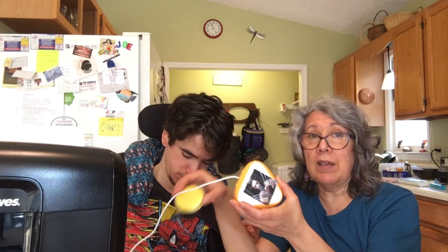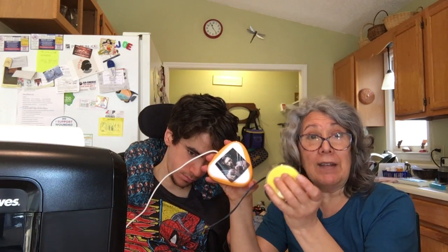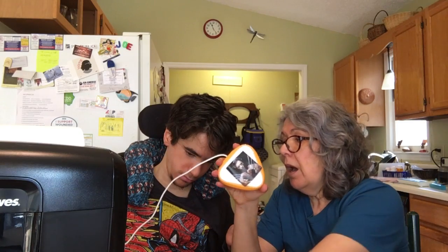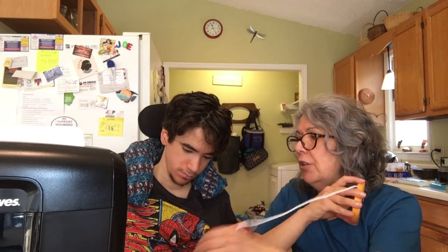So I'm going to show you, we have different kinds of switches here. Joe's AAC assessment, they recommended that Joe uses this kind of switch. This switch just uses pressure. You push it down like a button. But this is a proximity switch, and it lights up and it makes a sound, and when Joe puts his hand on it, he doesn't have to push it down. It works. It does whatever it's plugged into.